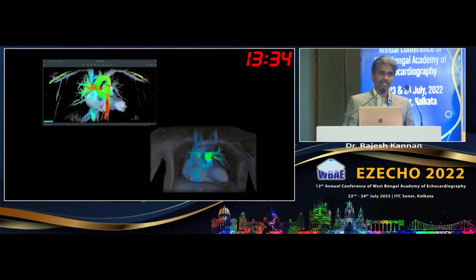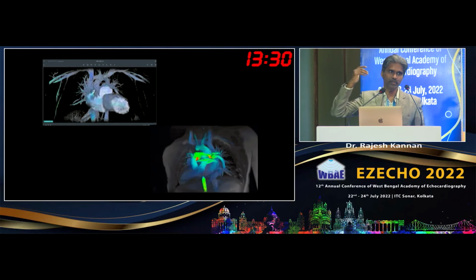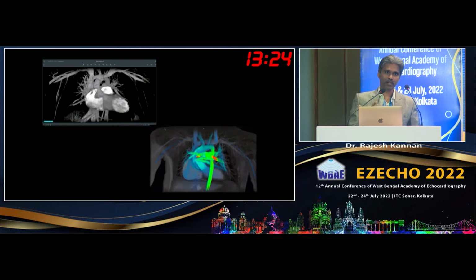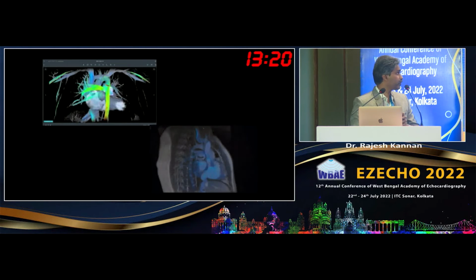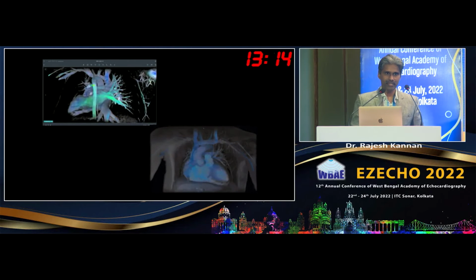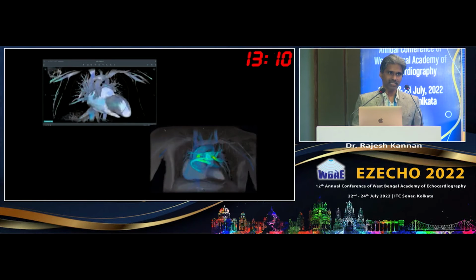Currently, there are newer imaging modalities available, not just the 2D PC, where you'll be looking at only the gray and white images. By doing the so-called 4D flow imaging, once we acquire it, which will take about 10 minutes or so, we can rotate it into any plane, and we can look at the flow studies across any vessel. That will be possible, and it is going to come. It is already available in some of the centers in India.